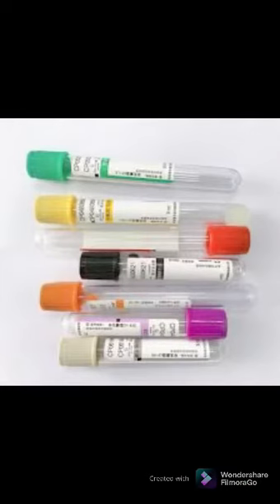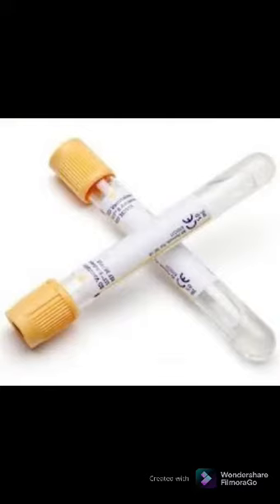The types of vacutainer tubes, the additives, the function of the additives, and the department that it is found in. First, we have the yellow top tube that has the SPS, meaning the sodium polyanethol sulfonate, and the function of that is used as an anticoagulant, and it is found in the microbiology department.